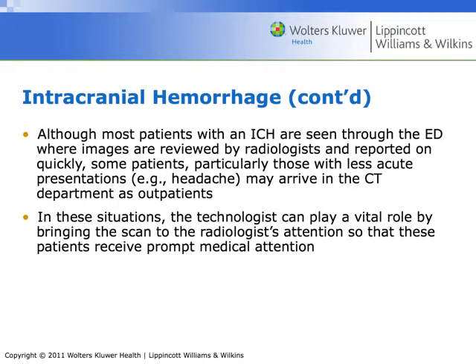So a lot of these patients are going to be coming to us through the emergency department, and the radiologists are going to be reviewing it within a brief period of time after the exam. There are going to be some patients every now and then who might show up with less acute things like a headache, and they might just come in as an outpatient. So it's really, really critical for us to consider the pathology of bleeds and CT scans as X-ray techs.